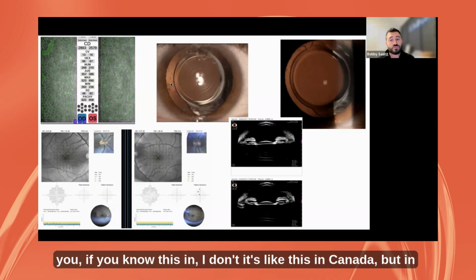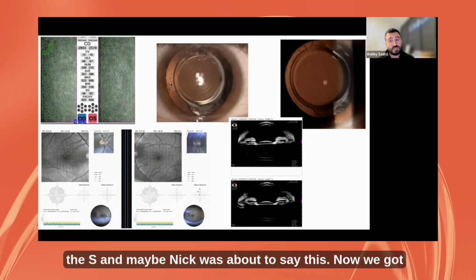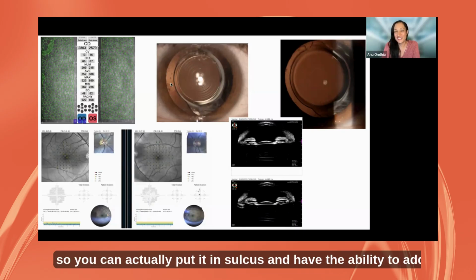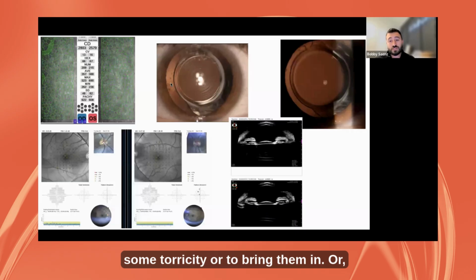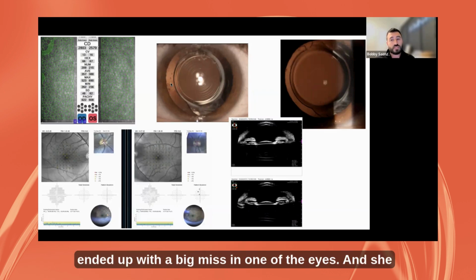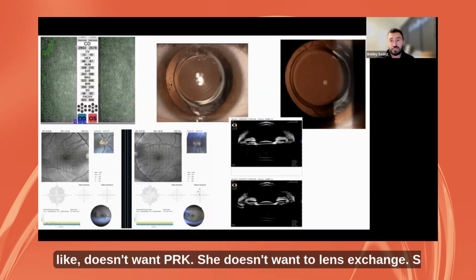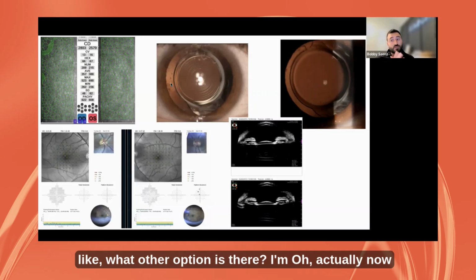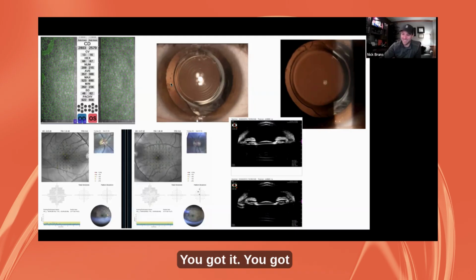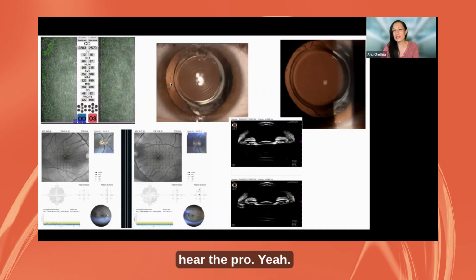I don't know if it's like this in Canada, but in the US, and maybe Nick was about to say this, now we have the LAL in a zero power lens. So you can actually put it in the sulcus and have the piggyback ability to add some toricity or to bring them in. Or I had a patient who's post myopic LASIK who ended up with a big miss in one of the eyes, and she doesn't want PRK, she doesn't want a lens exchange. She's like, what other option is there? And I'm like, oh, actually now, right, Nick? Ding, ding, ding, ding, ding. You got it. You got to hear the pro.